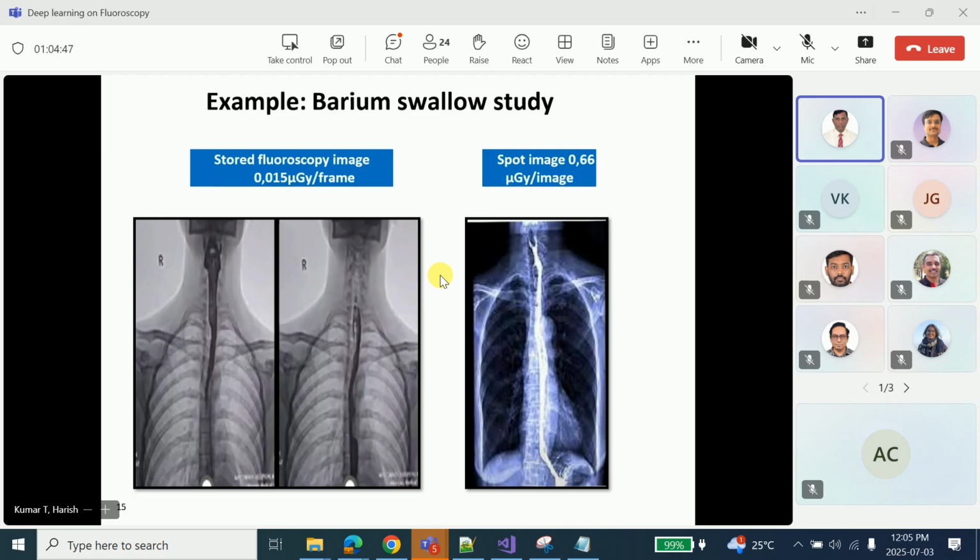Like Gary said, the maximum is 15 minutes for any human, but 5 minutes is not sufficient to do any angiogram. So you will have a buzzer there which will inform you that you have reached 5 minutes, and it will also have a buzzer at 10 minutes. You also have your radiation dose and your dose area product displayed there. So your physician, the clinician, will be in a position to decide whether to continue or not. But the regulatory stipulates 5 minutes and 10 minutes, which we have to adhere to. We have to follow.